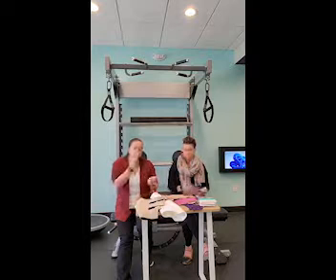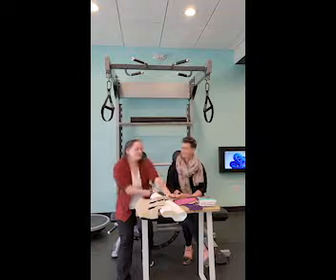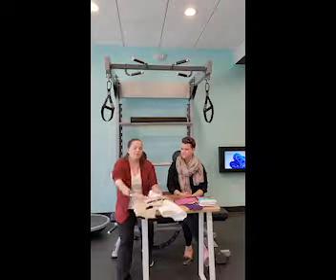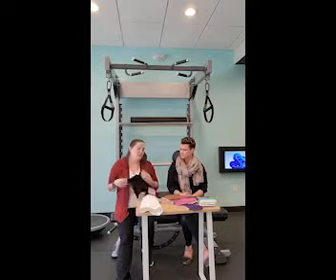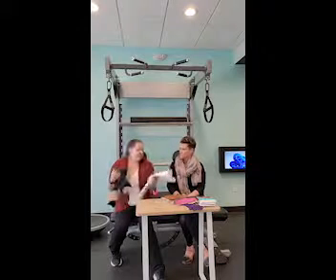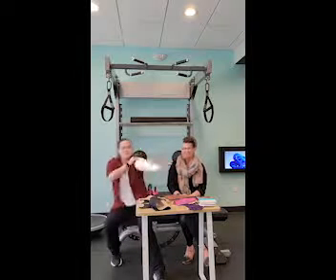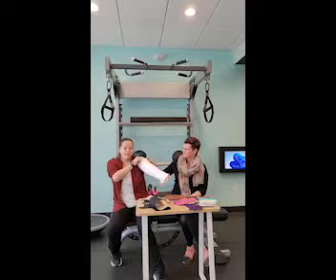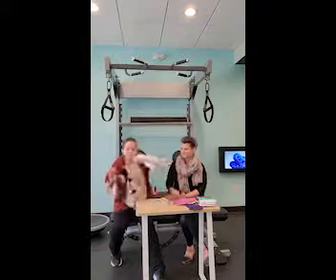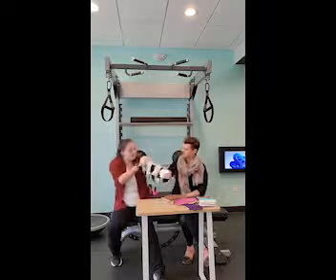Now, for those people who maybe can't wear a sleeve because they have decreased sensation in their arm, or post-stroke, where they're toned, there's also an option in an inelastic wrap, which I call a Velcro wrap. There is this nice foam padding, called soft compress. It's nice and soft, go figure with the name. That comes up like this, so I can move in this, and then this is the part that adds the compression. So I slide my arm in here, all the way up.